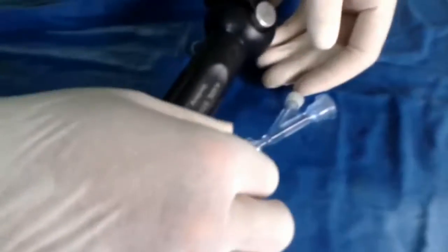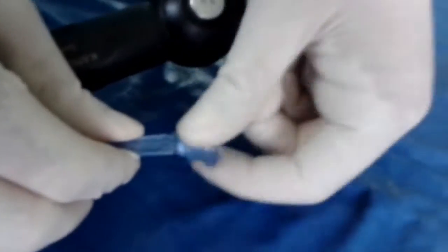In this case, the fibroscope seal is efficient to prevent irrigant backflow and to secure devices inserted through the working channel.